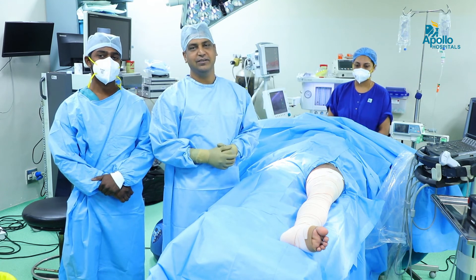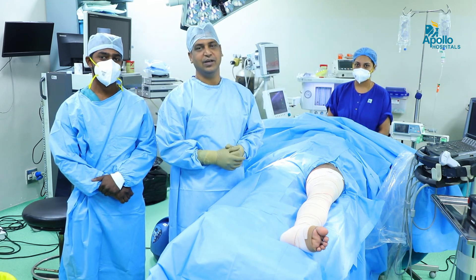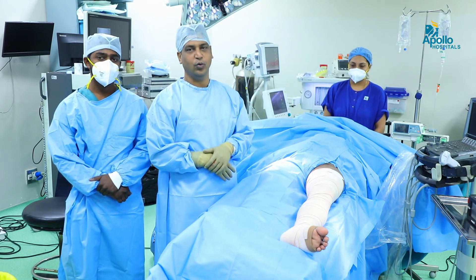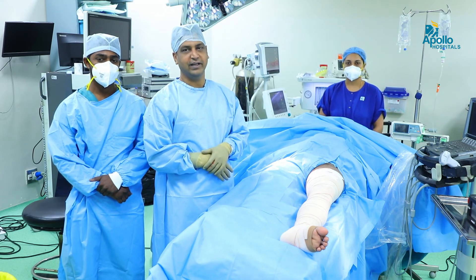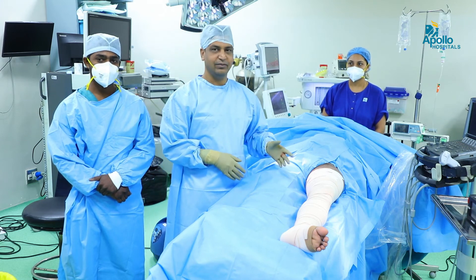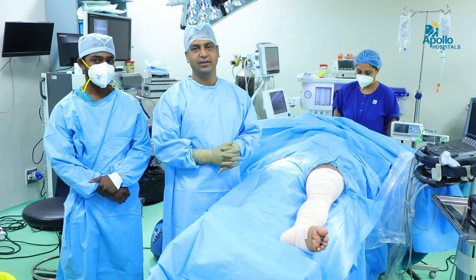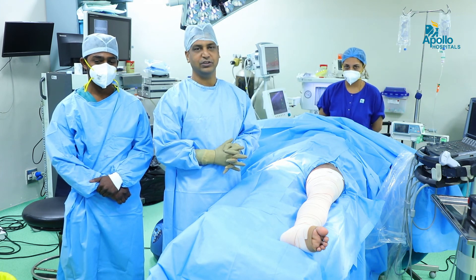After 2 hours we will make the patient walk, and he will go home after 4 to 5 hours. Thanks to the anesthetist and the entire team for successfully completing the procedure.